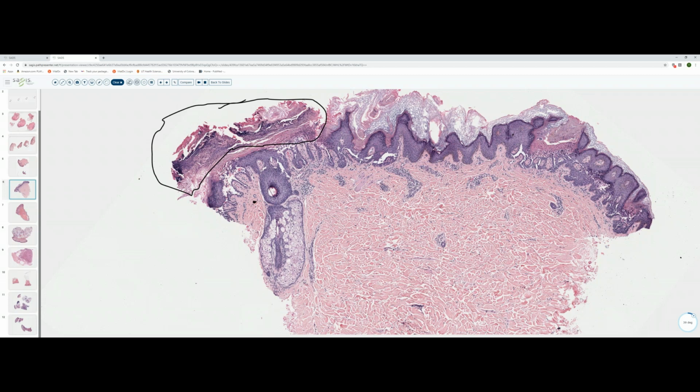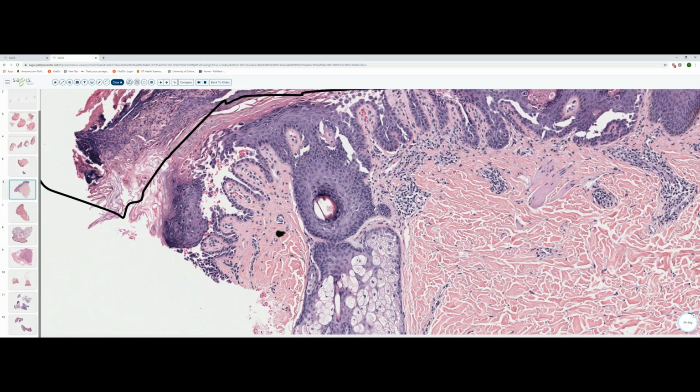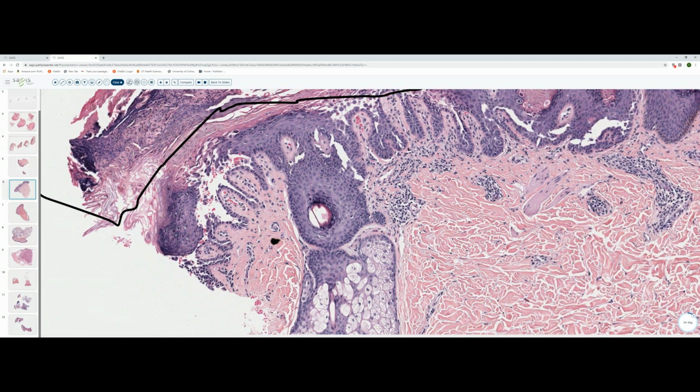But intraepidermal blisters, as we saw last week, can also form as a result of ballooning or intracellular edema in the setting of viral infections or nutritional deficiency disorders. You can get necrosis leading to intraepidermal vesicle formation, or, as is demonstrated here, acantholysis can lead to the formation of intraepidermal vesicles. And sometimes all of those mechanisms will be operative together.